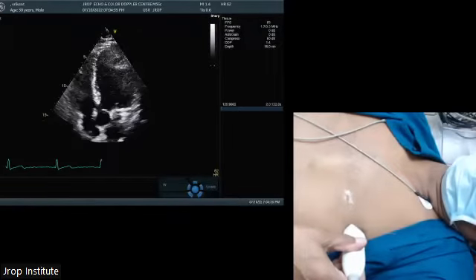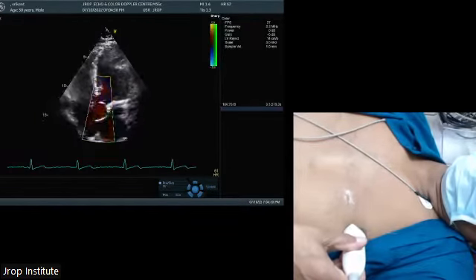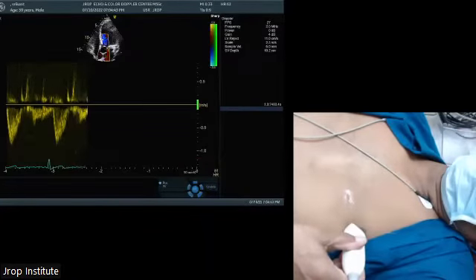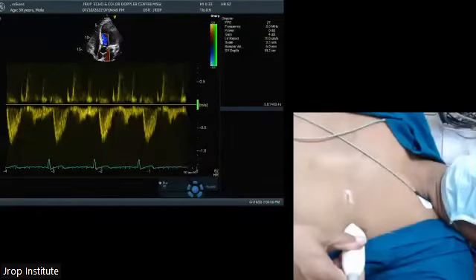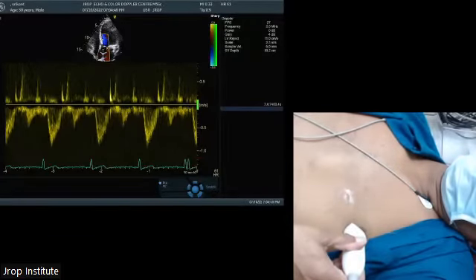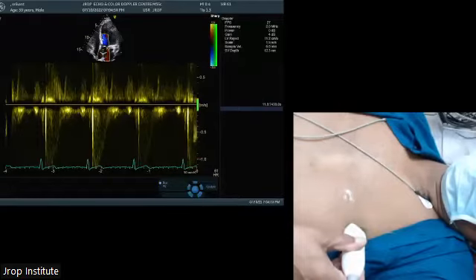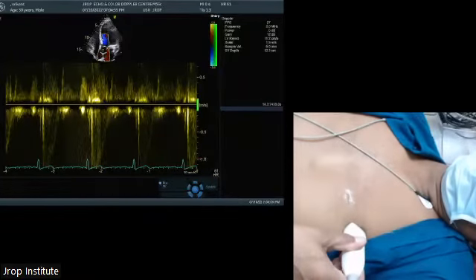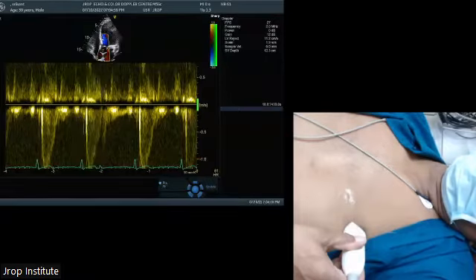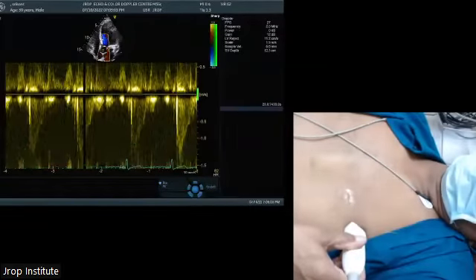Similarly, we can look at aortic flow and LVOT flow. If I'm keeping my cursor by pulse wave just before the valve, this is known as LVOT flow. Look, it's a cursor with 2 lines seen in it. If I move my cursor into the aorta, it becomes aortic flow. Correct? Now you see aliasing. So I'm increasing the scale or baseline.